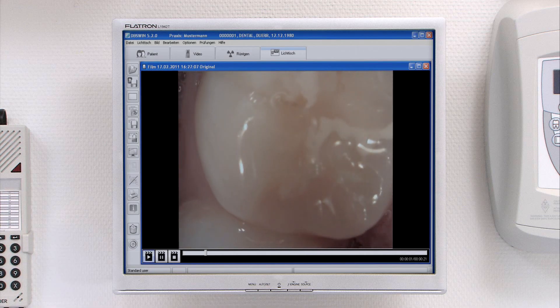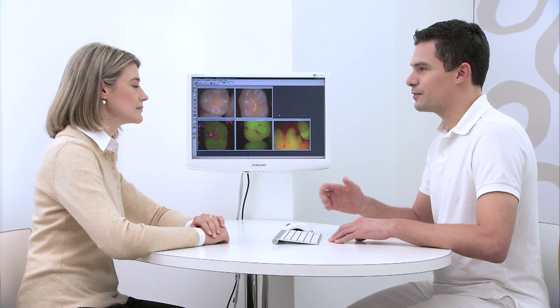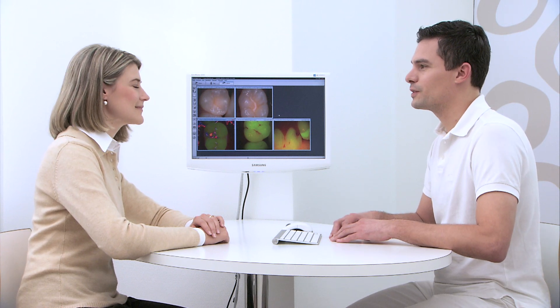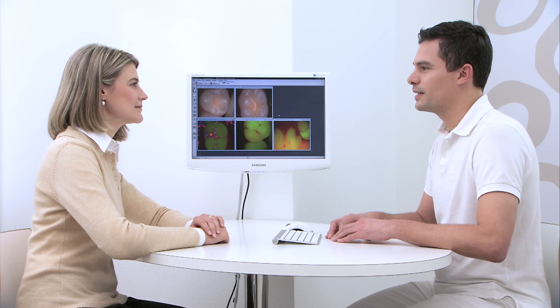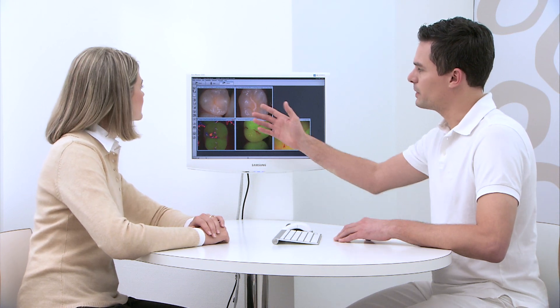Video clips can be easily recorded in order to, for example, document the current state of a patient's tooth. The image data can be used at any time during a discussion with the patient, as the basis for commencing treatment or for showing the stages of the treatment to be carried out.